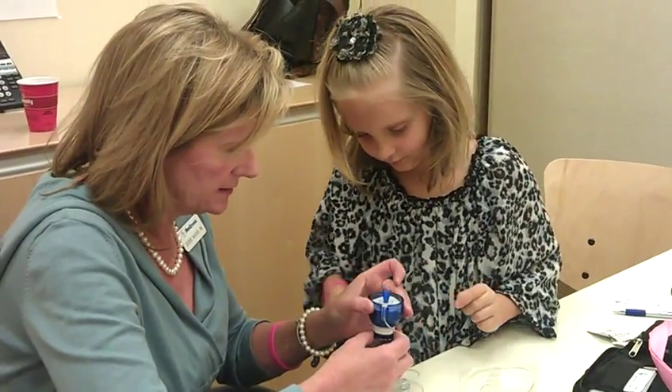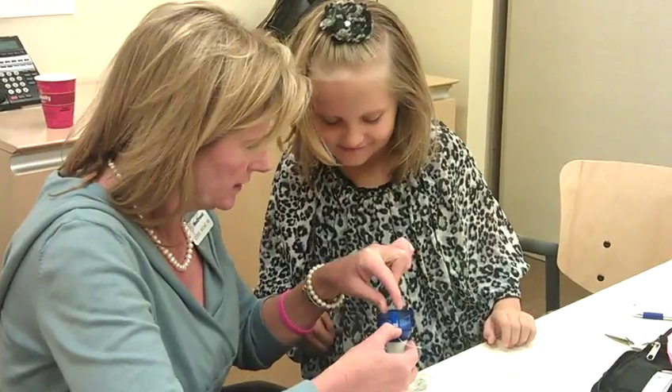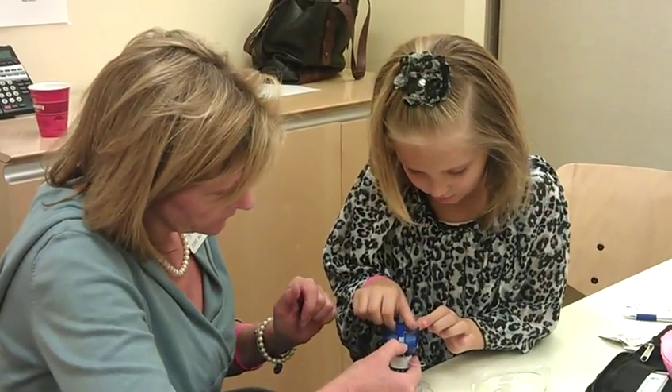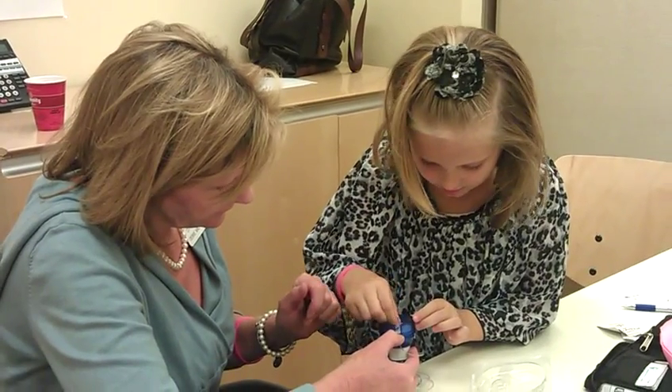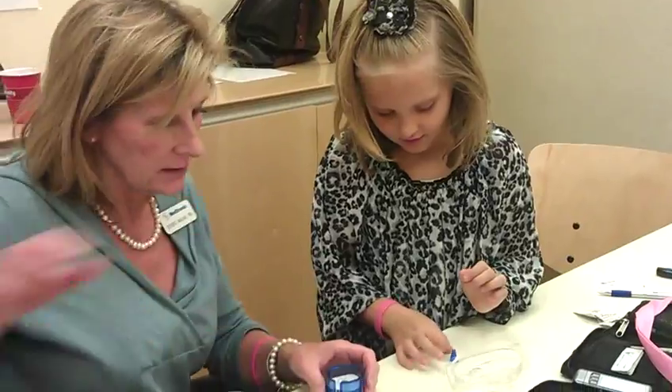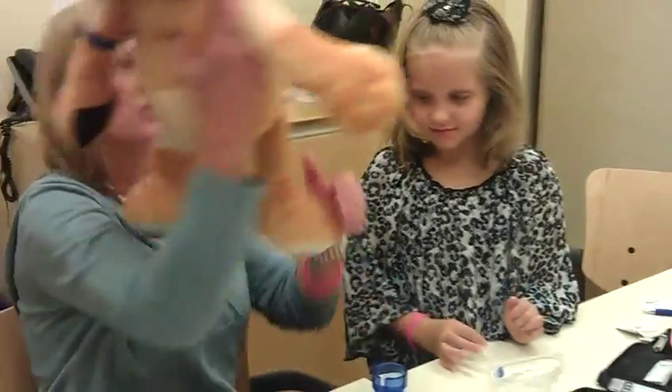Perfect. Now let me retract it. What I want you to do is kind of twist and pull up on and uncover that needle. This way? Perfect. Oh my gosh, you're so good. I learned that.